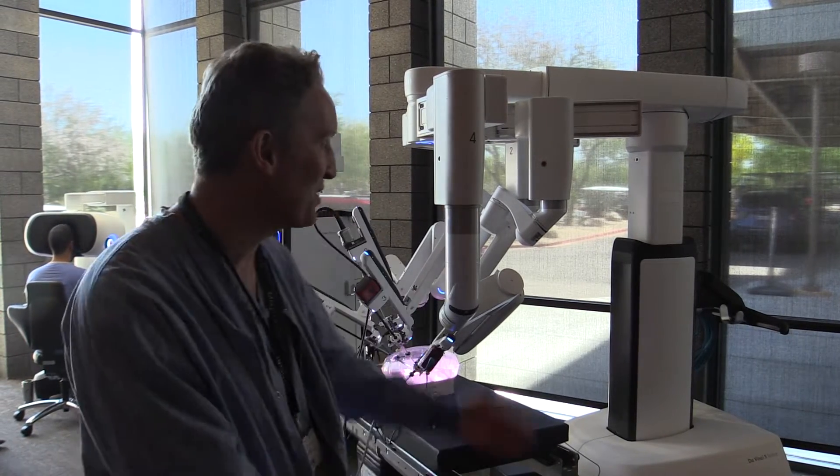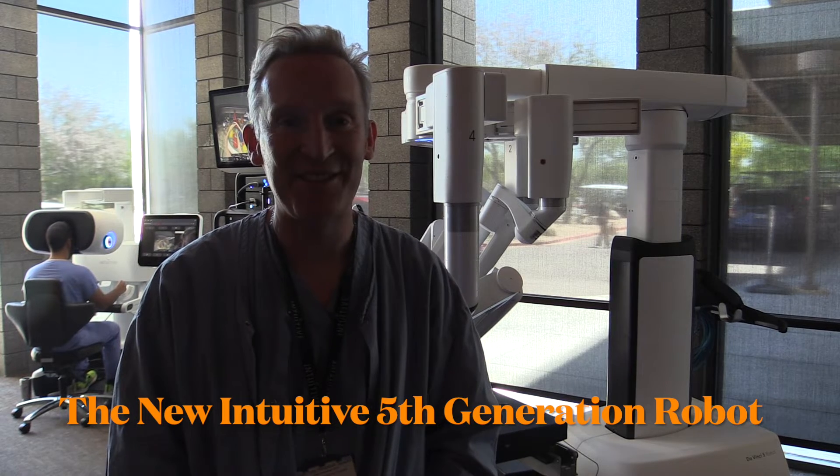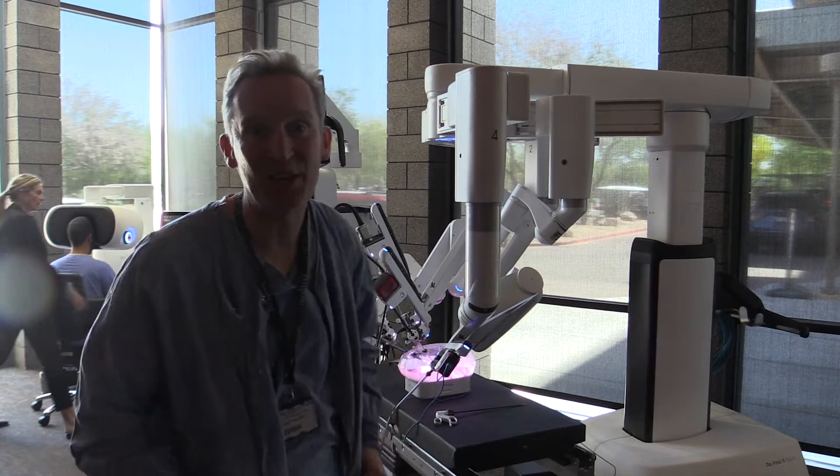Hello, Joel Dunning here. I'm very excited because I have discovered a DaVinci 5 robot here at the Mayo in Arizona. I'm here with their awesome intuitive team who have told me that there are over 150 different design changes to the patient cart.